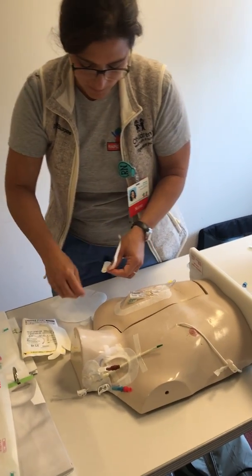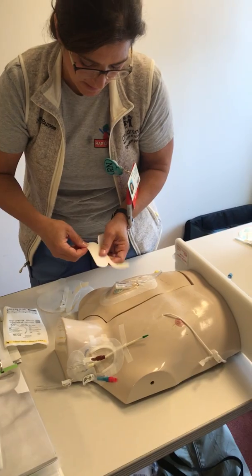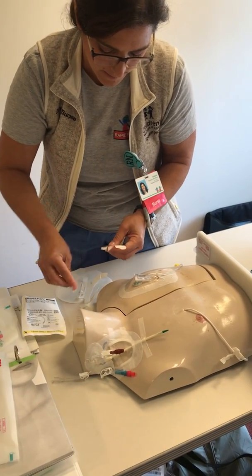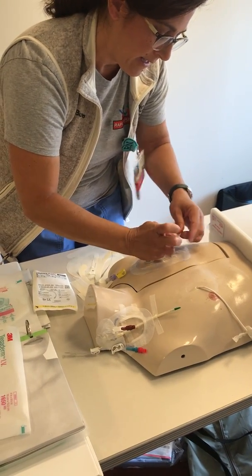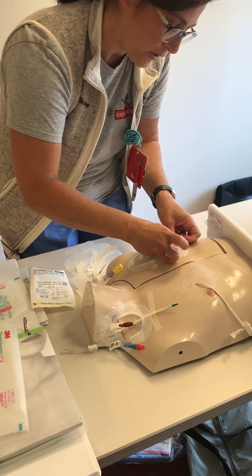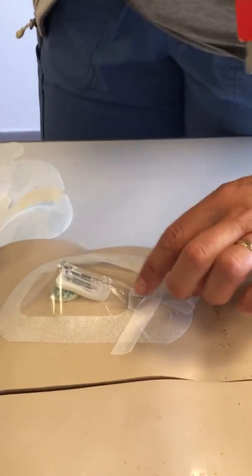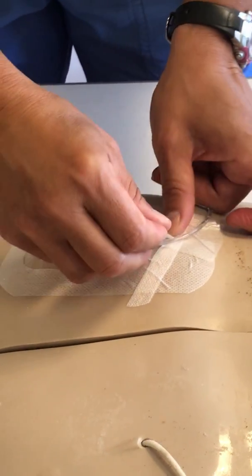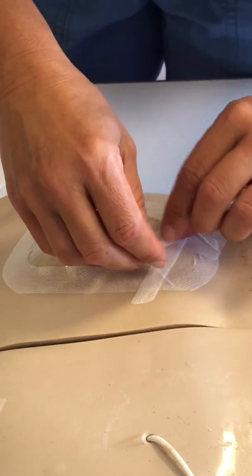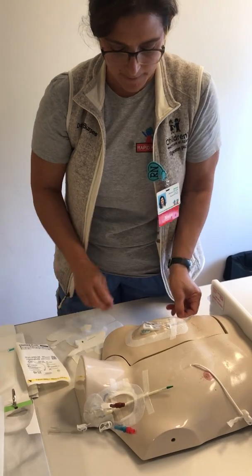And another key thing with all lines is make sure that you're lifting the line. Have somebody hold that line up all the way like that and put that little strip closest to the line so it occludes everything. And as you can see, there's nothing there. I like to put another one just on top just to make sure. Last thing I want this kid to do is get an infection. So I put it on one side, kind of pinch it, and put the other side, and do it like that. Again, I should have had another bio patch on there, but for the sake of the video, I don't have that. And I think that's it.